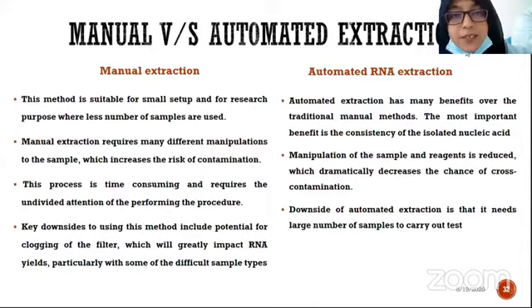However, if the result is not clear after the PCR and the final result is not clear, or if we have doubt that there is some issue with the sample, like I have already mentioned that some samples come like very viscous samples. So if we analyze some issue with the sample, we extract the sample again in duplicate or even in triplicate. But usually we do not use replica in COVID-19 sample.